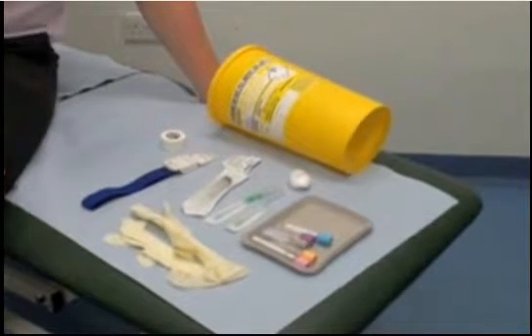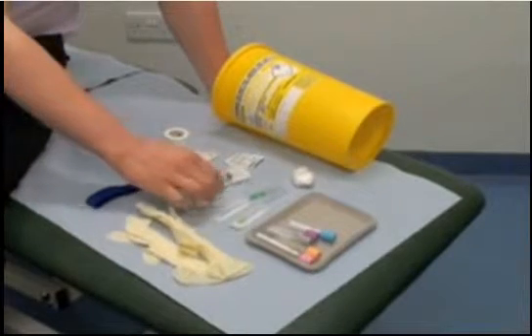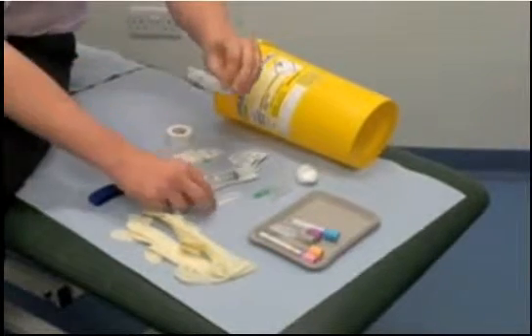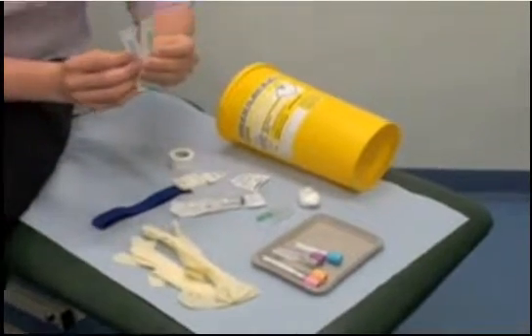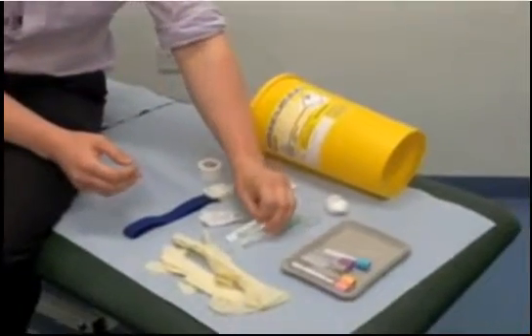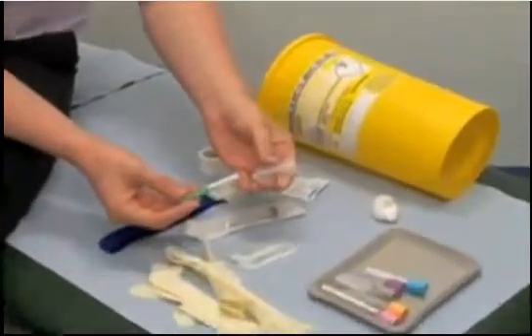You can either use a needle and syringe — we've got a couple of different needles here. The different colors indicate different sizes, as they're usually color coded according to their gauge.